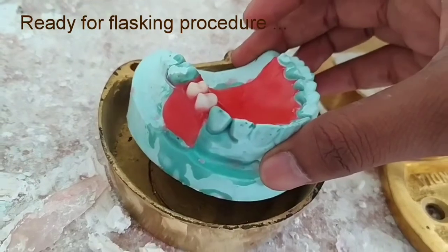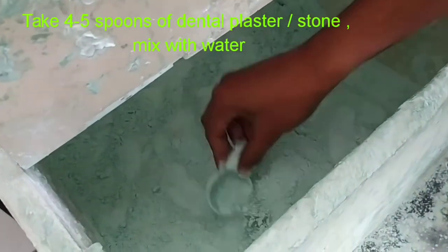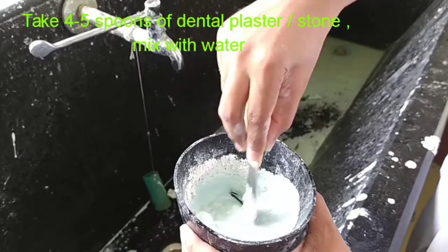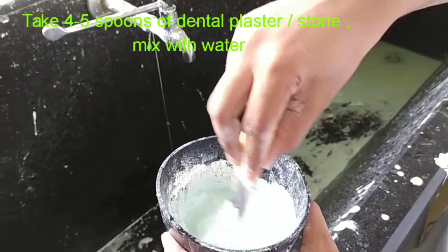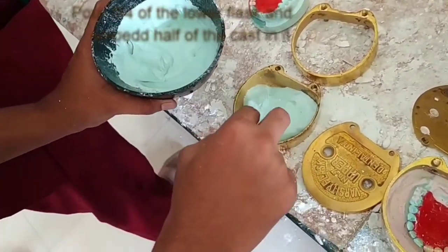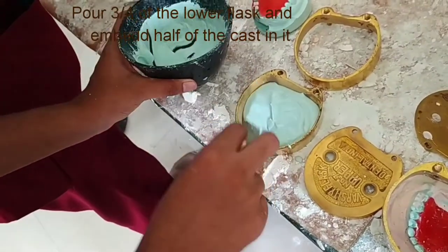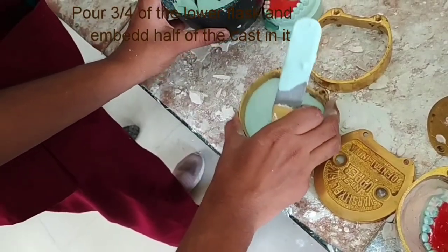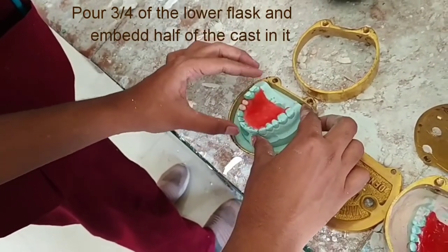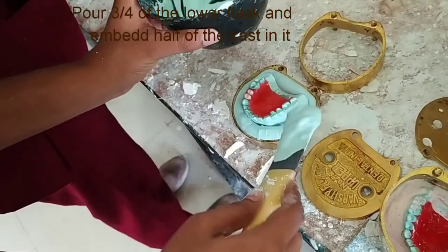Let's begin with the procedure. First we will take the plaster material, as much as is required to fill the lower unit of the flask, mix it with water, and pour it into the lower unit — almost three-quarters full. Now we will put our cast in it so that half of the portion remains open.